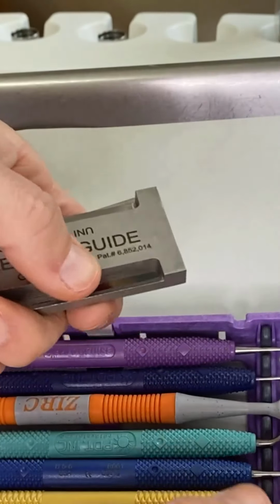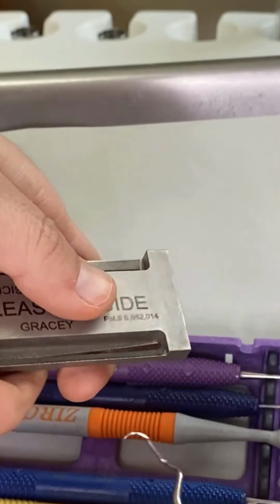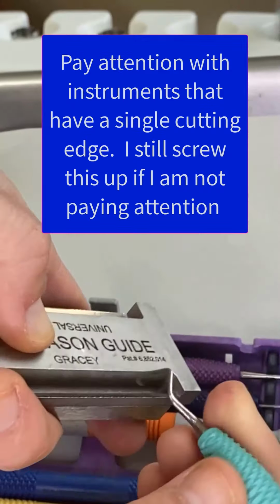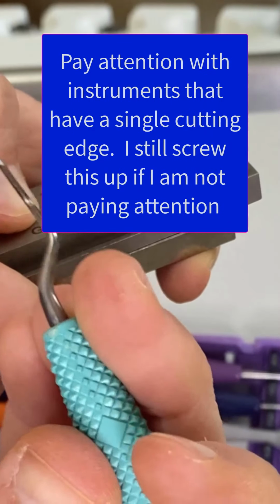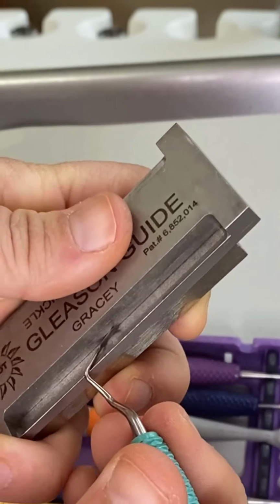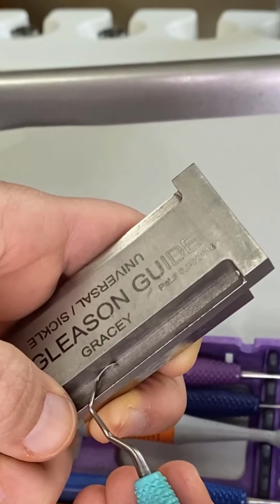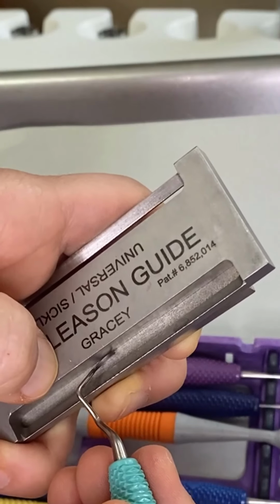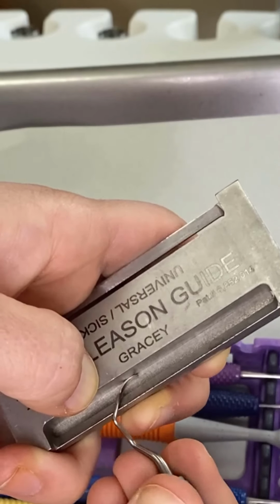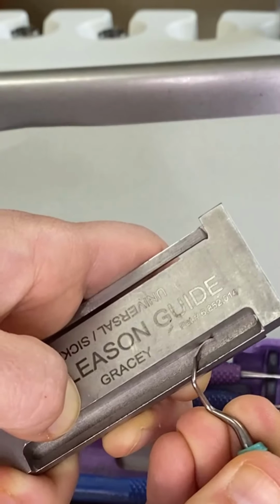So I'll flip and I'll do a Gracie now. Let's go with, I love a 17-18. Gonna do the same thing. Oh man, I sometimes do like to jack that up. Okay, that's way better. That felt wrong. So same thing: on the wall, on the ramp, on the stone. Again, making sure that you're not lifting up. Make sure you're not pulling up this way. And if you are just getting used to it, go slow.